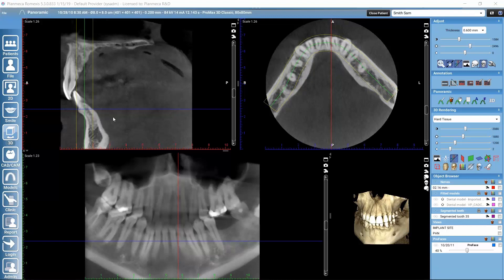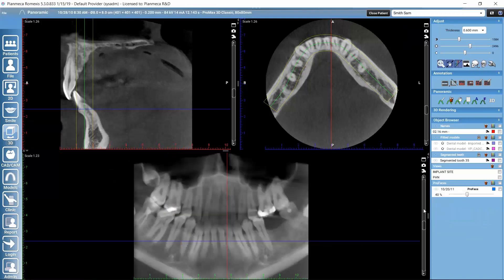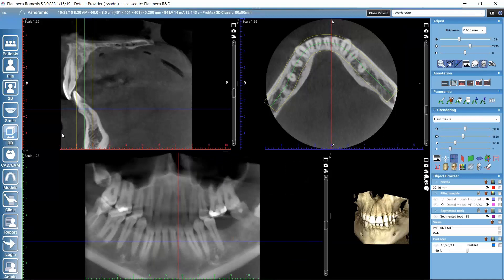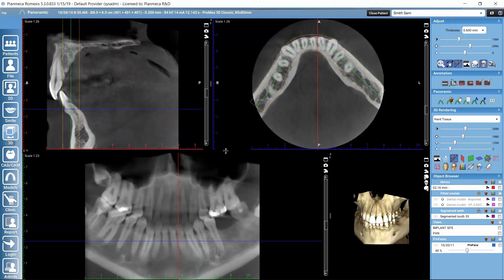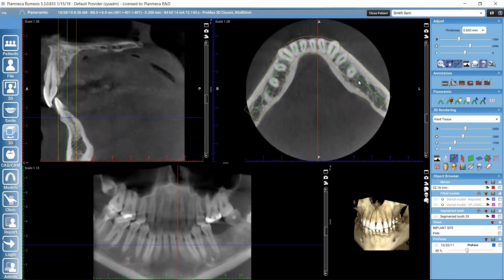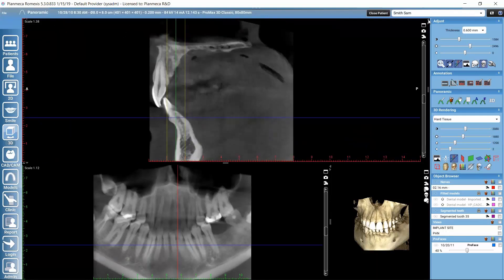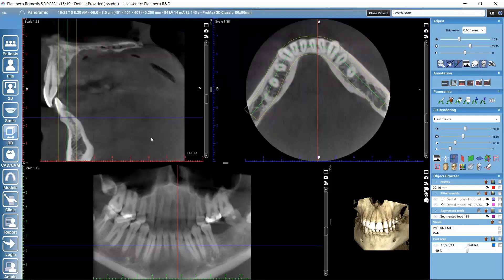Here in the panoramic module we can adjust the selection of views. Clicking the show/hide renderer icon hides the 3D rendering. There are also further options — we see small icons between the views that we can drag to change the relative size of different views. Additionally, there are small arrows in the corners that can be used to hide other views completely. This allows us to adjust the layout.